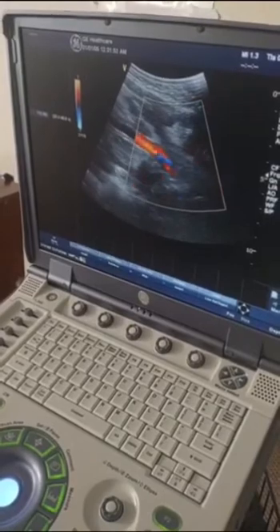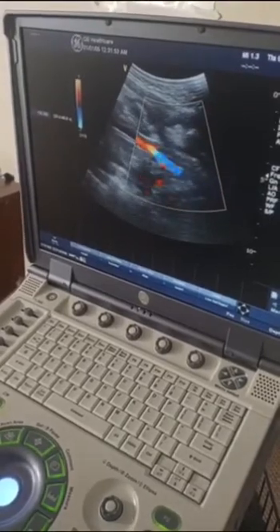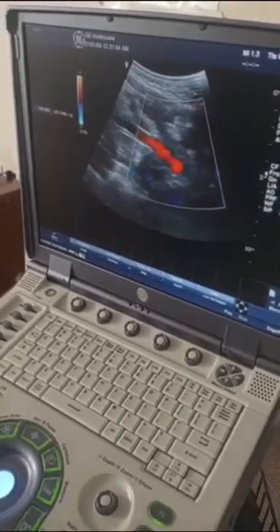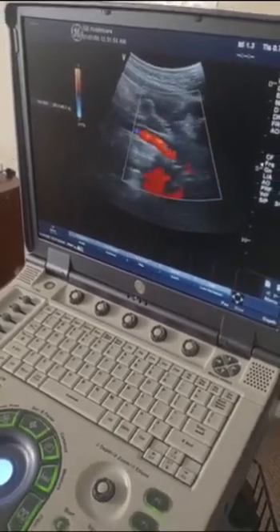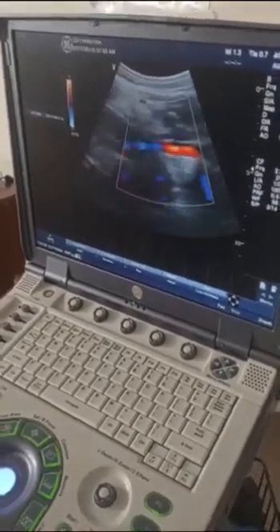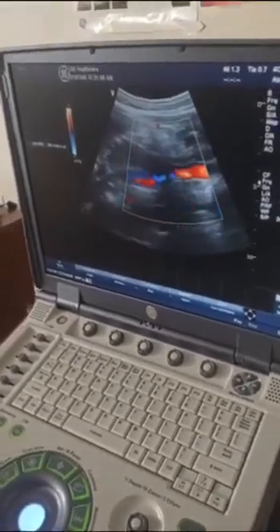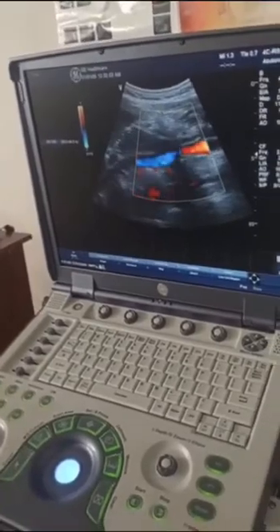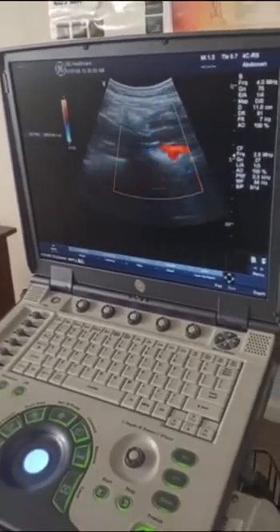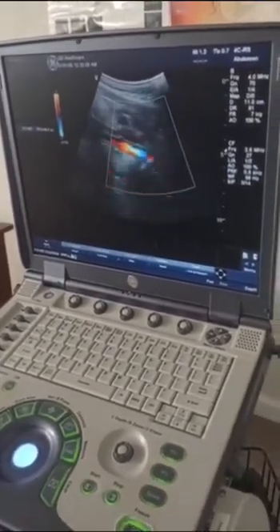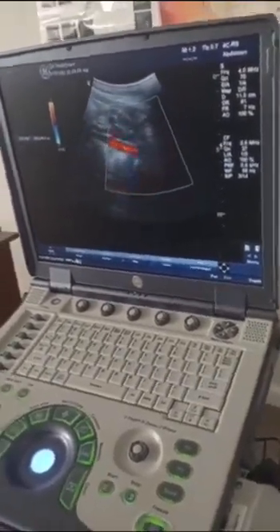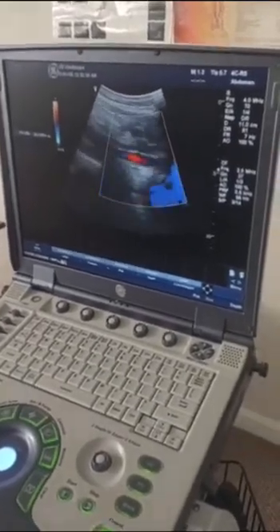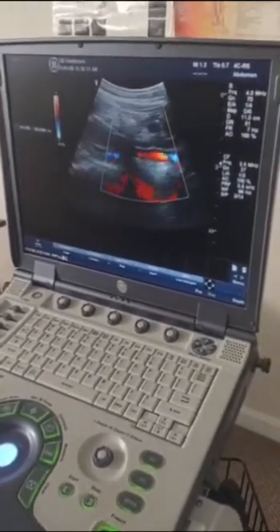This is the distal segment of the IVC. You can see, because the IVC is sort of diving down, there is a change in color. You're going from blue, which is the IVC draining into the right atrium, as opposed to — as I wrap the probe down — going into the limbs of the patient.